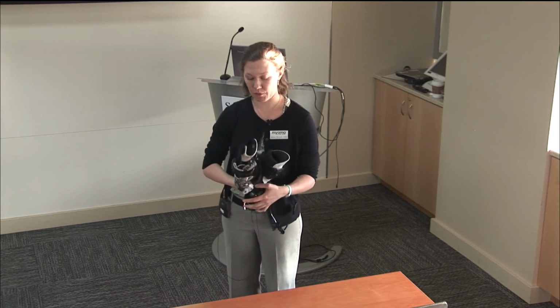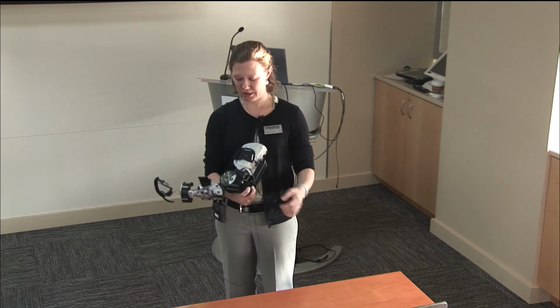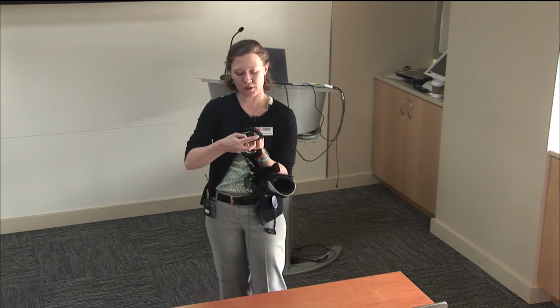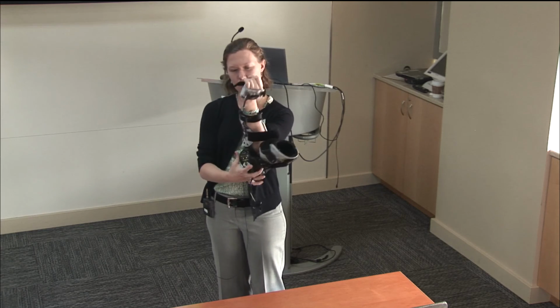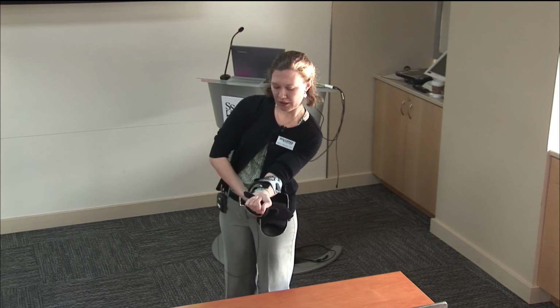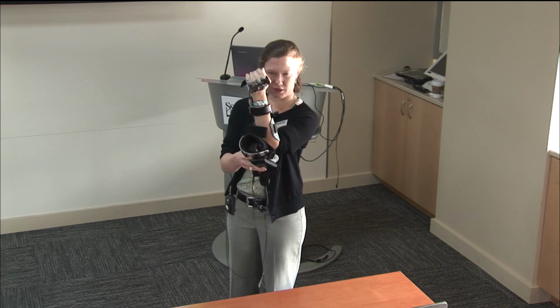It is what we refer to as a passive wrist, wherein the patient has the ability to mobilize it on their own. So the way that it works, if I can slide my hand in there at this awkward angle, is that the patient has the ability to flex it and extend it. They have the ability to pronate and supinate. Let me see if I can get that at an angle that you can see it. Pronate and supinate this way, and then radial and ulnarly deviate it.